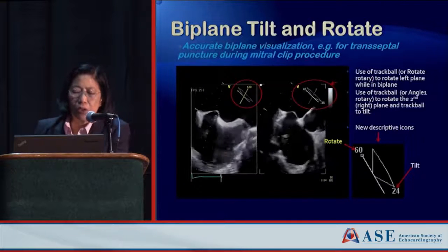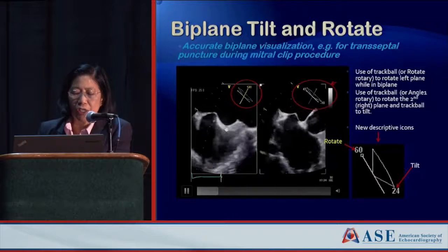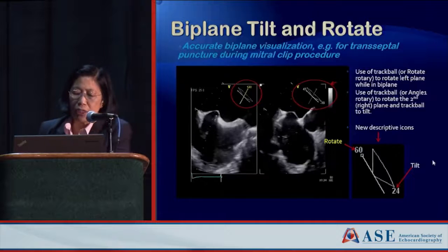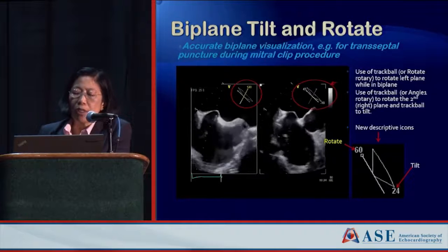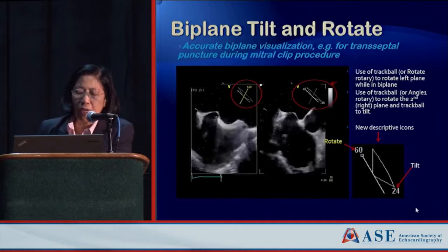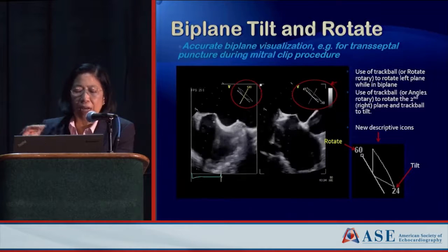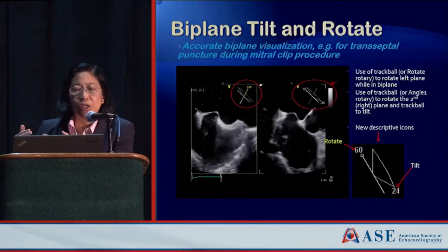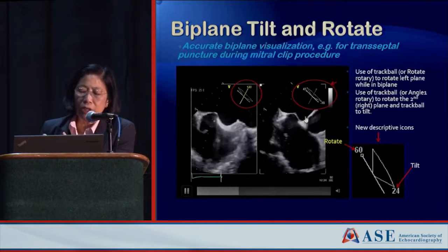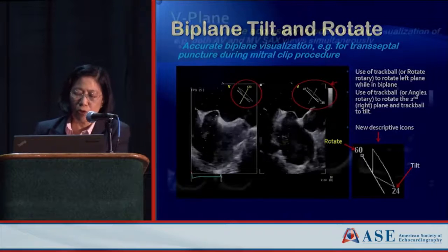The biplane tilt and rotate feature: normally the orthogonal plane in a simultaneous biplane image allows you to rotate it along the longitudinal plane. But biplane tilt and rotate means you can use the trackball to rotate into a different plane, not being held to the longitudinal plane. In the interventional space — for instance, for a transeptal — this gives great flexibility to see how anterior you are, including the short axis of the aortic valve, to avoid a very anterior puncture.